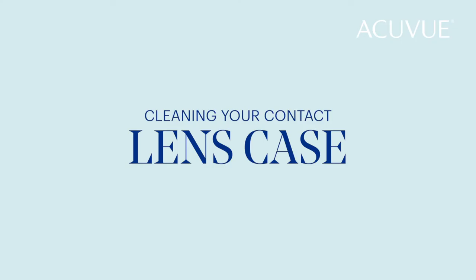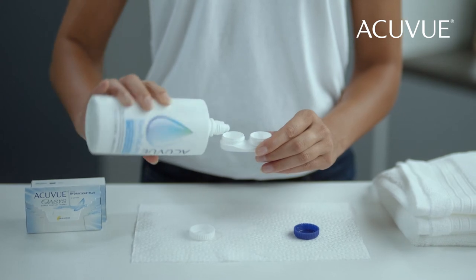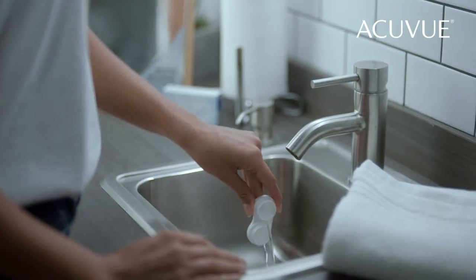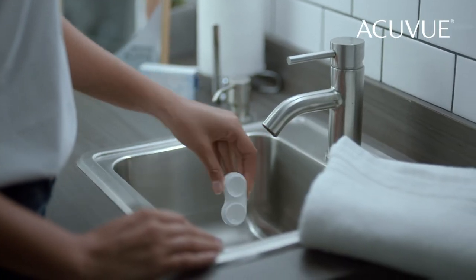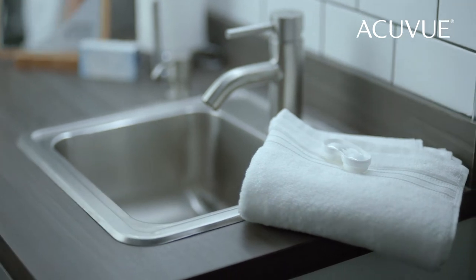Keeping a clean contact lens case is as important as washing your hands, so get in the habit of rinsing yours with solution after each application. Once it's all rinsed, shake any excess solution out of the case and let it air dry upside down on a lint-free towel until you are ready to remove your contact lenses.